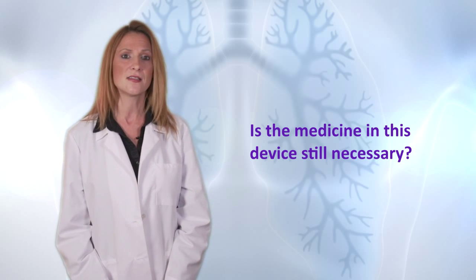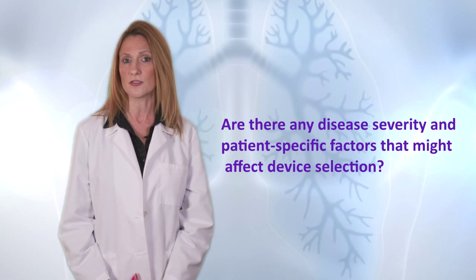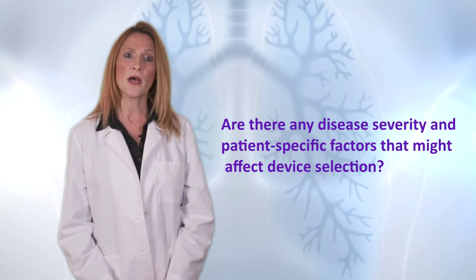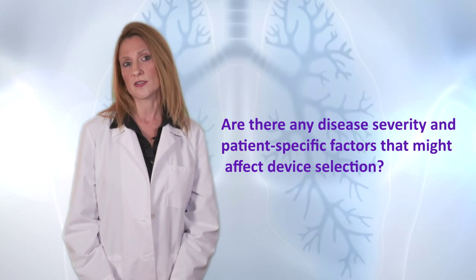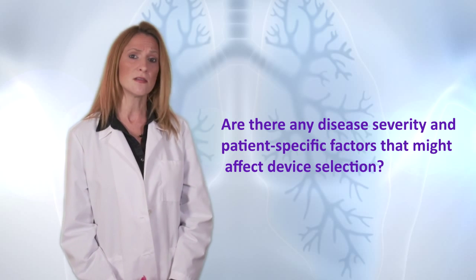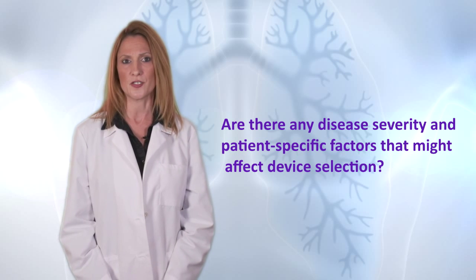Consider if multiple devices need to be reviewed during the session. Are there any disease severity and patient-specific factors that might affect device selection? Some drugs in all drug classes may have more than one device option available. For example, a dry powder and metered dose inhaler. Drug efficacy must be considered, of course, but often there is some latitude in device selection. Those with severe COPD may have difficulty with rapid inhalation or breath holding. Nebulized medicines, despite their expense, may sometimes be the best option.